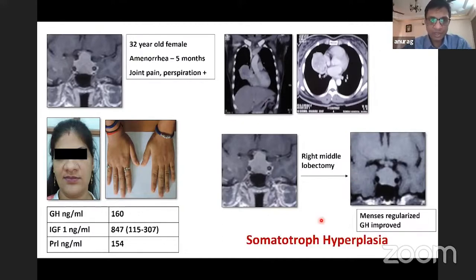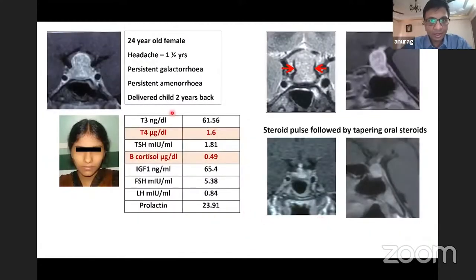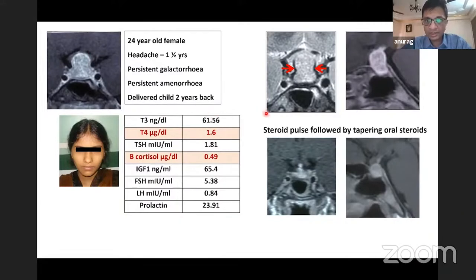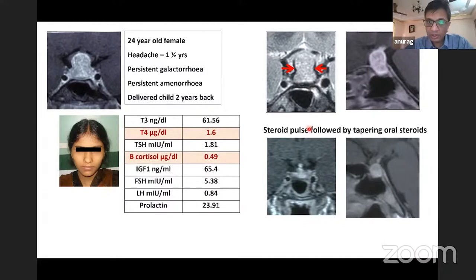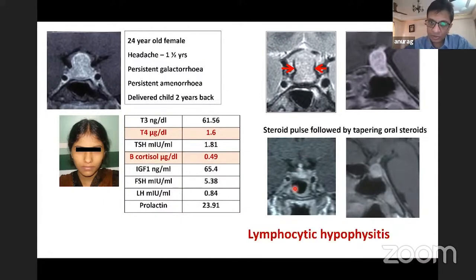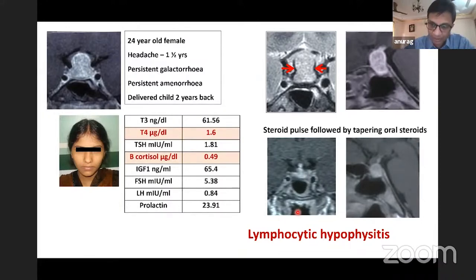This was a case of somatotroph hyperplasia over an adenoma. Similarly, a 24-year-old lady with post-delivery persistent amenorrhea and headache was diagnosed as a non-functioning pituitary adenoma and referred for anesthesia fitness. We recognized a pattern: preferential involvement of the thyroid and cortisol axis. The T2 dark sign was clinching for lymphocytic hypophysitis (LYH). A steroid pulse was given and surgery was omitted — this was a case of lymphocytic hypophysitis mimicking NFPA.